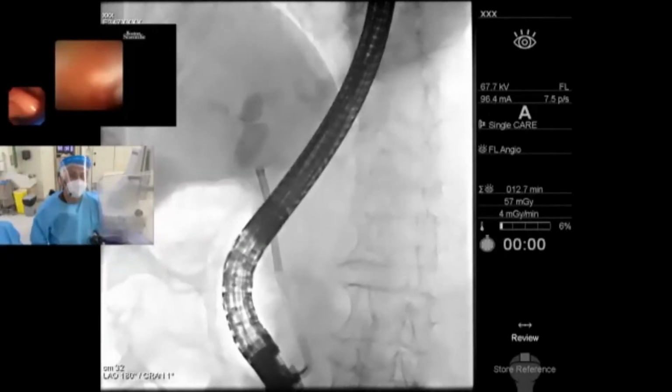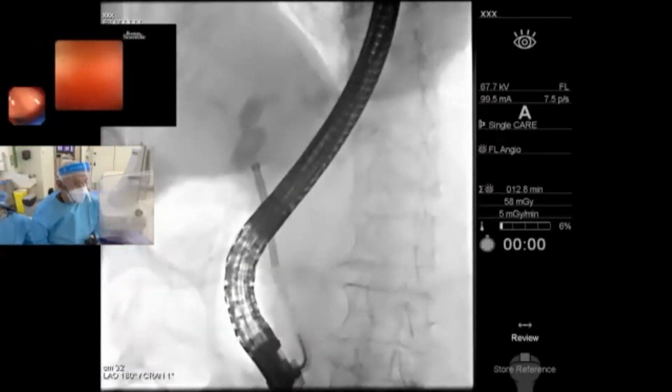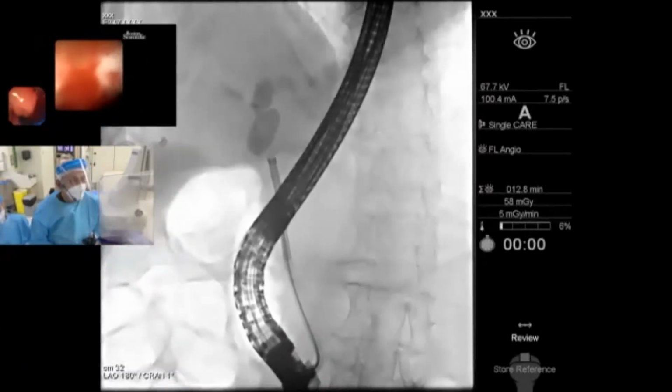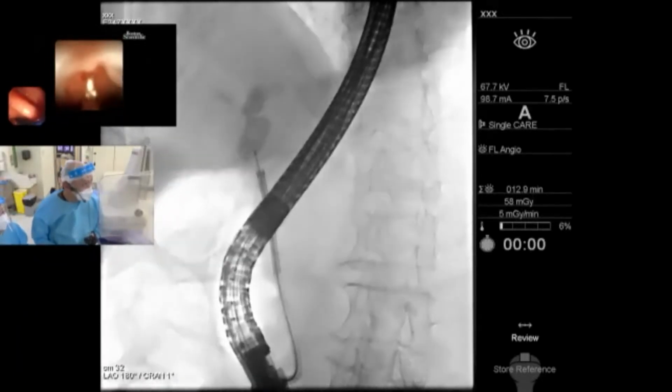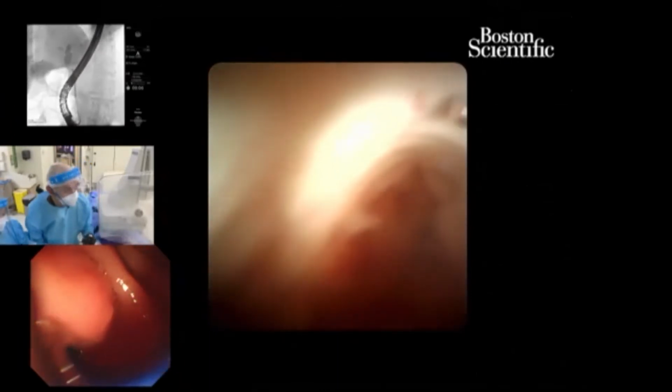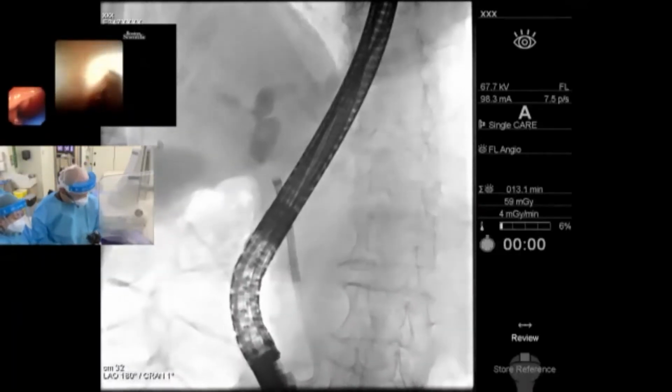And then now I can push the bite out because I've gone past the bend, and if I push the bite a bit more, it actually helps me to negotiate the bend. And now I can push it up through the channel. So that's my technique. That really answers one of the attendees' questions about what kind of technique you use to insert the spy bite biopsy, or even when you're using laser: it is just moving the whole SpyGlass through the angulation and then moving your instruments inside it.